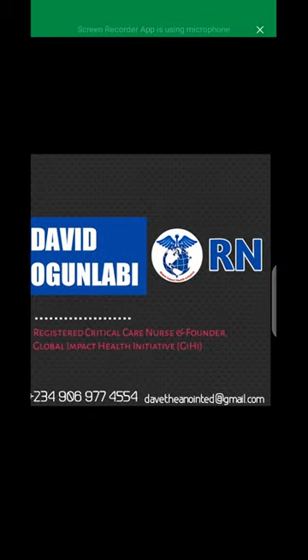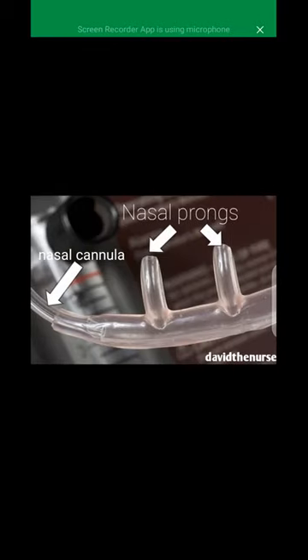Okay. The first one, the simplest of them all, is the nasal prongs. In my subsequent videos, I will pick up another one and we'll discuss it one after the other. But in this video, I'll be focusing on the nasal prongs. Here you have it on the screen.